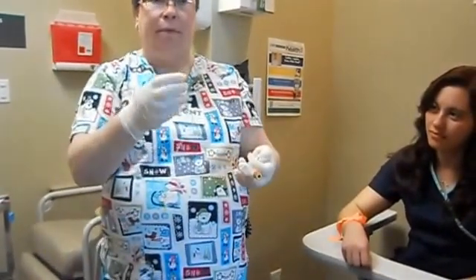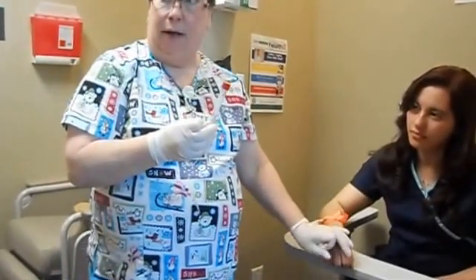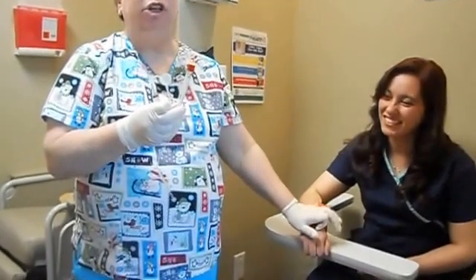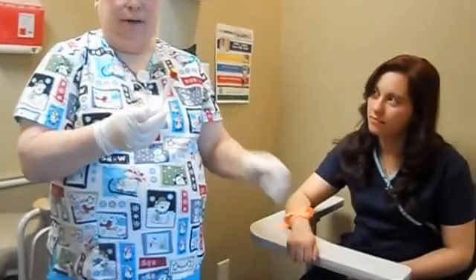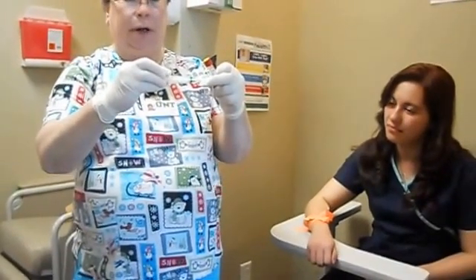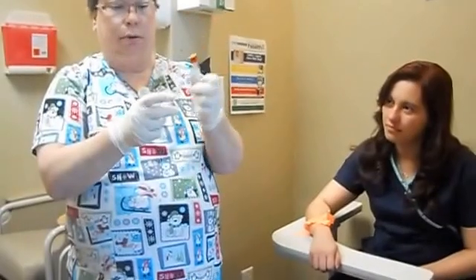Okay? Some people's veins are so fragile that the vacuum in these tubes is too strong and it will literally collapse the vein. Have y'all ever had that happen when you drew blood? You never had that happen? Okay. Well, it will, usually on older people, or people with real tiny veins. And when you use a syringe, you have to go really, really slow to get the blood to come up, because you don't want to do it fast, because then the vacuum is identical to the tube.